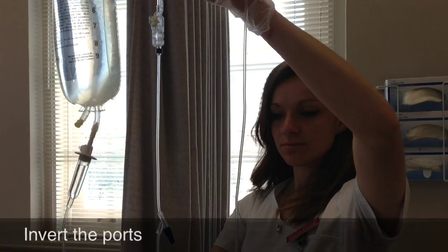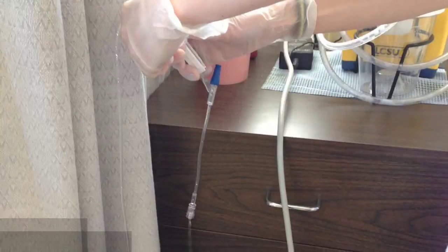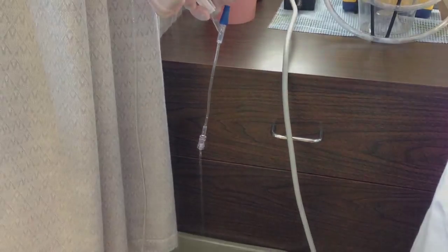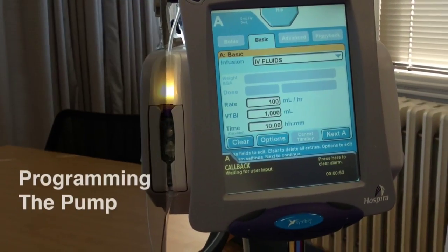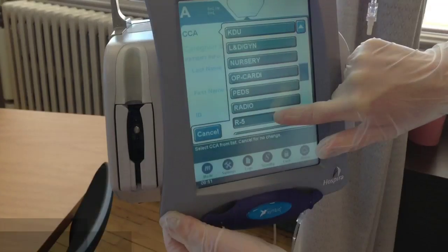Once the fluid starts running, it's important to invert all of the ports — this allows the air bubbles to escape. You want as few air bubbles in the line as possible.